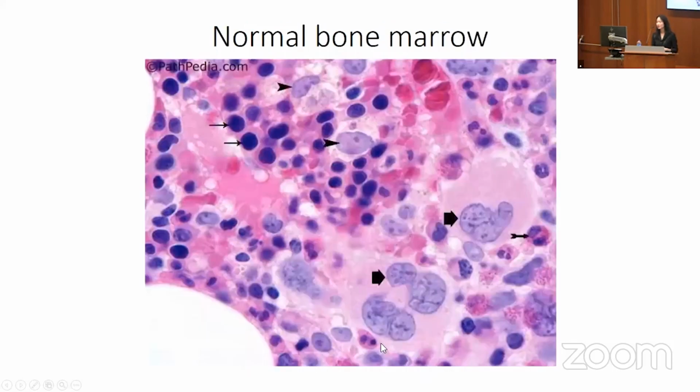This is what it looks like on the core biopsy that we get at 9:30 in the morning. Okay, this is actually an island of erythroid precursors. So these are the cells that give rise to red blood cells. And in normal bone marrow like this one, they actually form islands around macrophages. And then you've got megakaryocytes that often are near blood vessels, giving off platelets from this cloud of platelets that they have on the outer edge. So normal bone marrow has architecture that is useful to see, because when it becomes dysplastic, it loses that particular architecture.